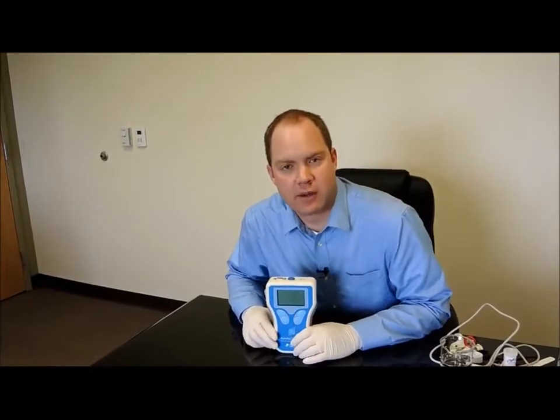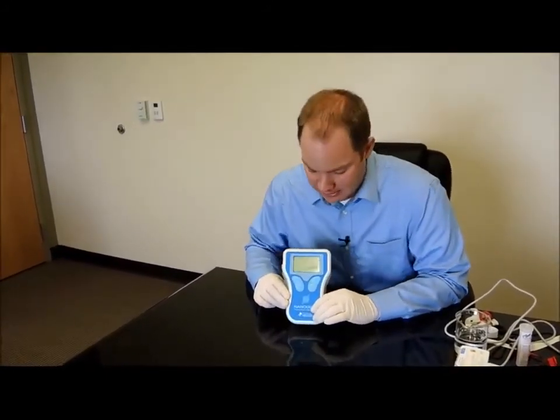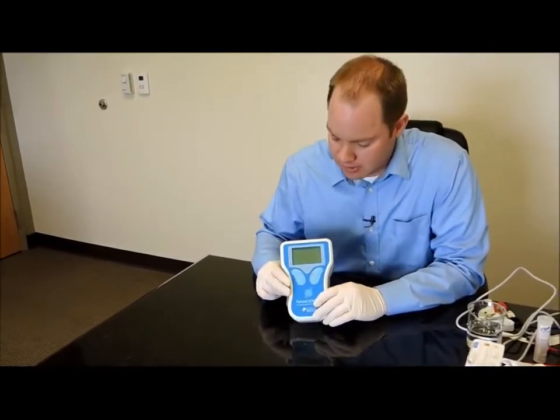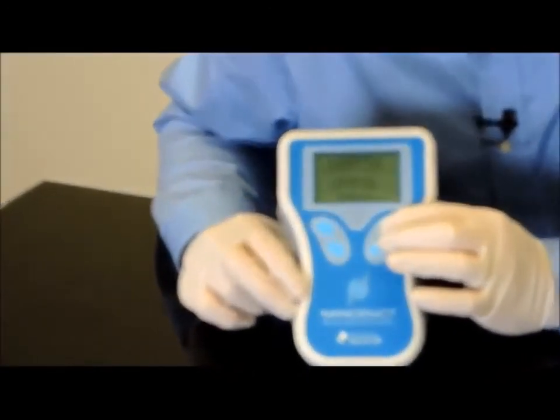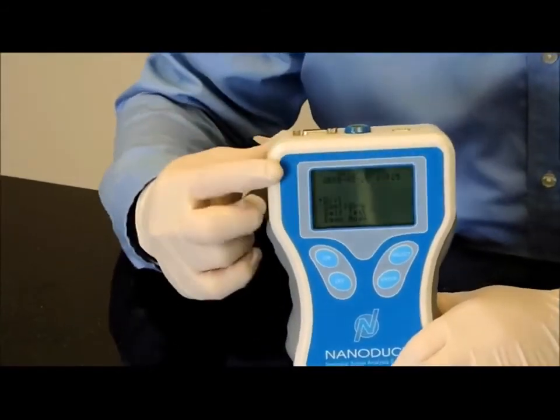As part of this training, I wanted to show you one more thing that can help you demonstrate the Nanoduct to a potential customer or even to parents that maybe are concerned about using the Nanoduct on their baby. That's the demo mode. So right now the Nanoduct is off. I'm going to show you how to turn on the demo mode, and you do that by pressing the select button and on at the same time. Keep holding the select button and it will go to the setup menu.